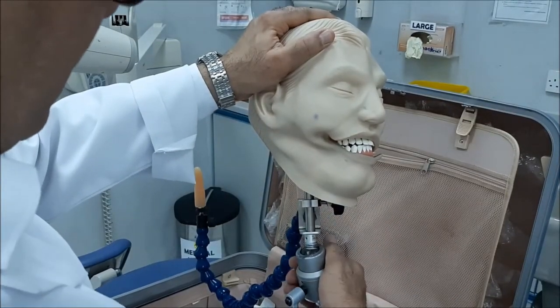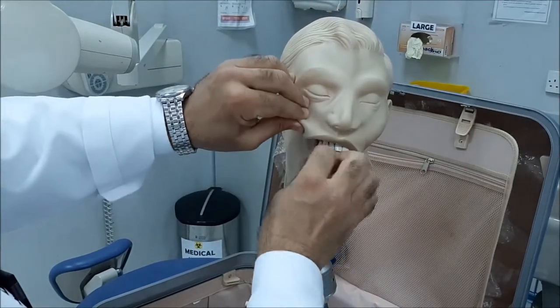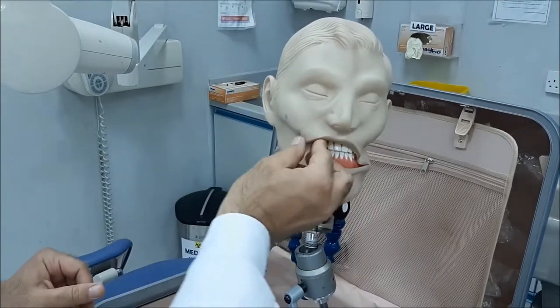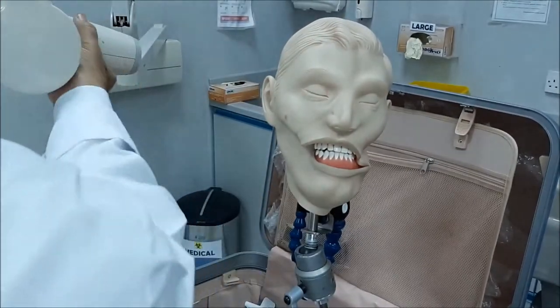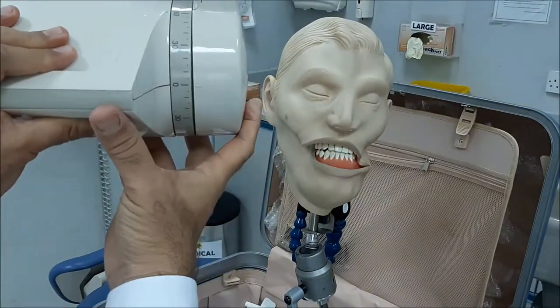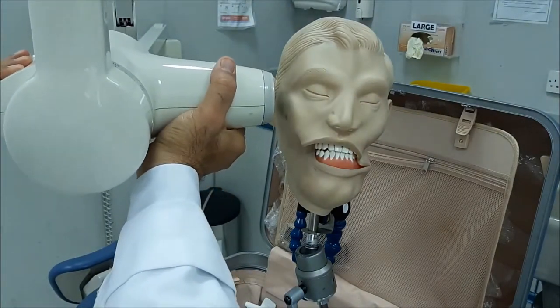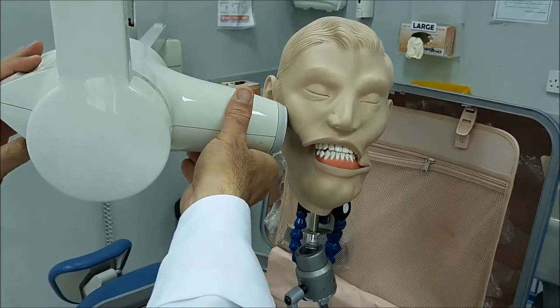Once the film is placed in position, we will direct our beam. The beam is directed just like we did in the pre-molars: you give a plus 10 angulation. This is zero angle — you raise it up and give it a plus 10. This is the vertical angulation.